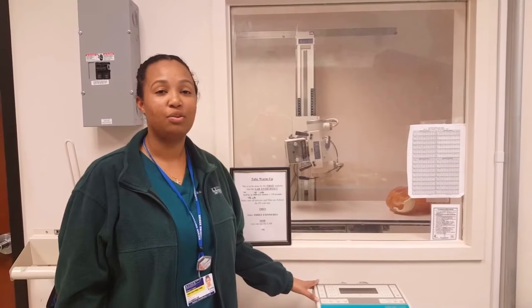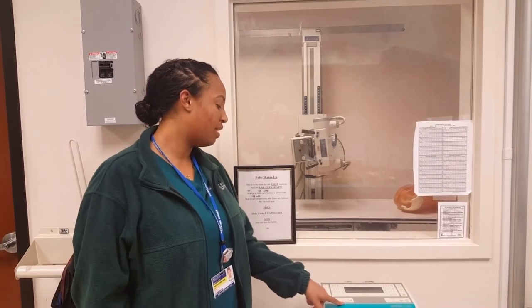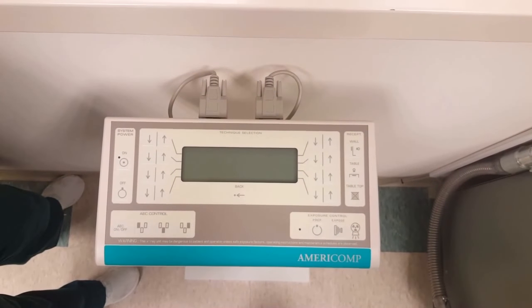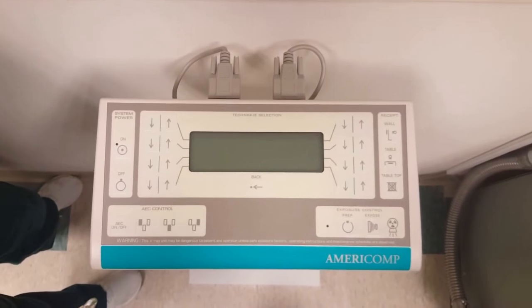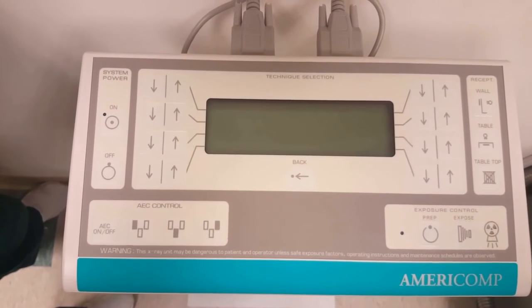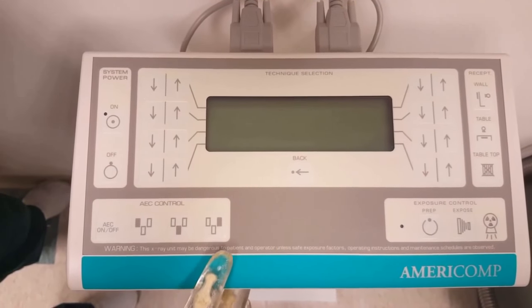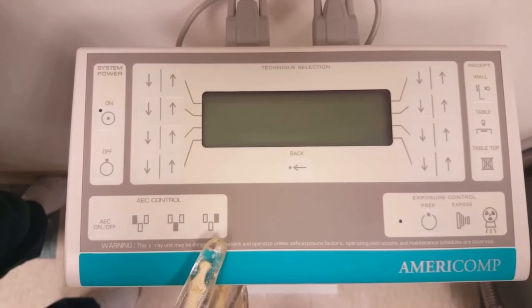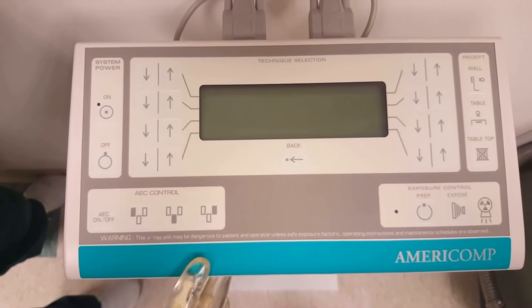Thanks for joining me in the X-ray room. Here's the control panel that controls the X-ray tube. If you come in a little bit closer, you can see that the AEC control has 3 chambers to select from. Of these 3 configurations, there are 7 possible combinations that you can choose to create the best image for your patient. This will be the first one, this will be the second, and then this is the third. It's possible for you to choose the first and the second, or the first and the third, or all 3.